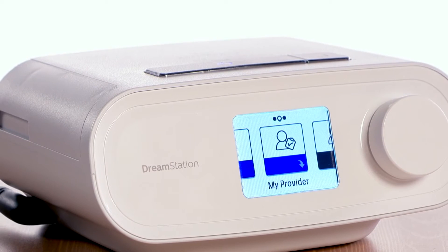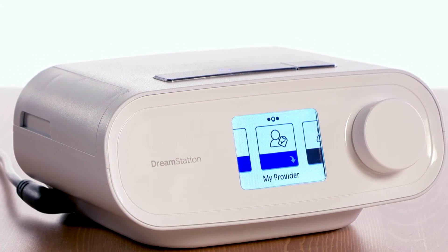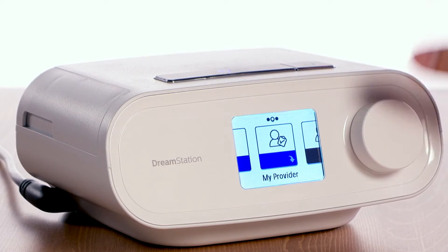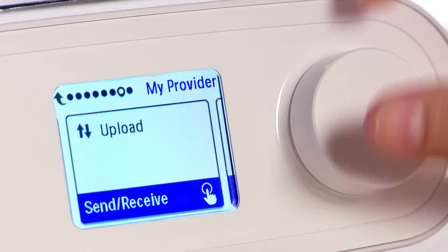Your provider may ask you to execute a manual upload of your data. If requested, go to the My Provider menu and navigate to the Upload screen. Press the control dial to initiate an upload.